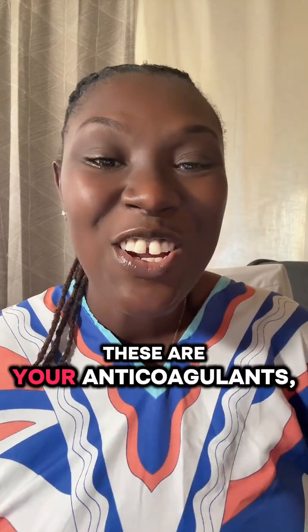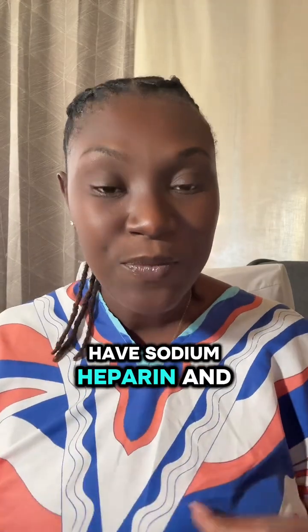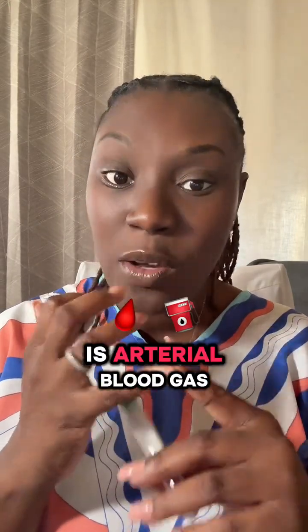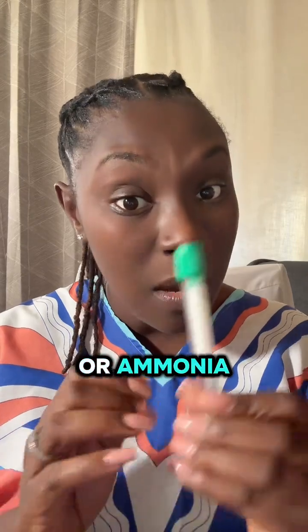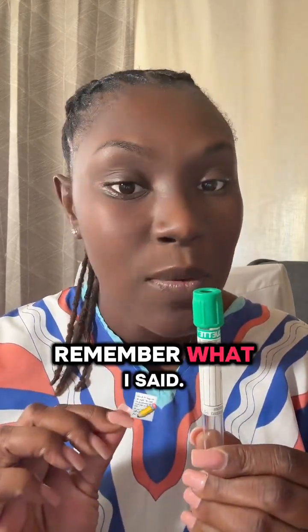Okay? Next, we have our green top. These are your anticoagulants, our heparins. So we have sodium heparin and lithium heparin. One major test that will always go with our heparins is arterial blood gas or ammonia that can be collected in this tube. Now, remember what I said.